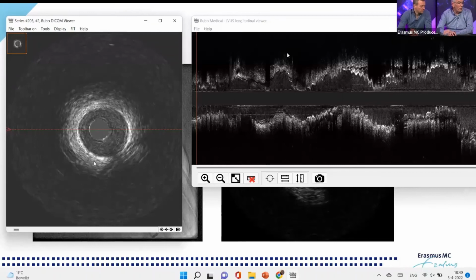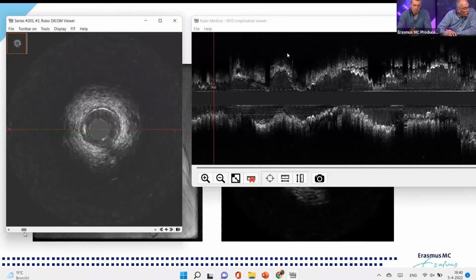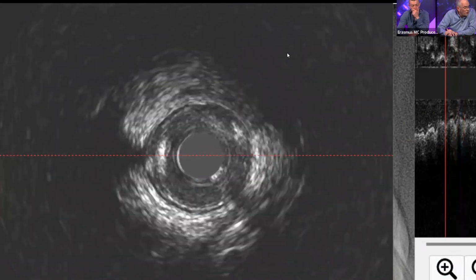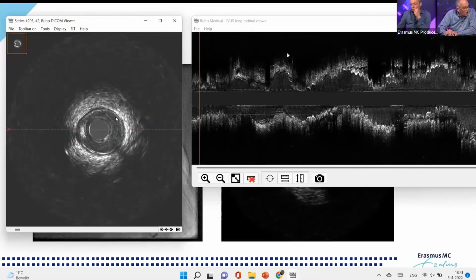Good. Well, let's have a look here. Distal, normal vessel. You see the vessel is small, but that's because we were deeper with the IVUS catheter now. If we go more proximal, then hey, there we see a normal vessel, but it's much smaller. And what you also see here is that your intima is brighter, and that looks like a spasm. It has nothing to do with plaque, and you can often resolve that with some intracoronary nitrates. So this is not a real vessel, this is spastic, and if you compare it with a normal vessel more distal, you can appreciate the different appearance of your intima.